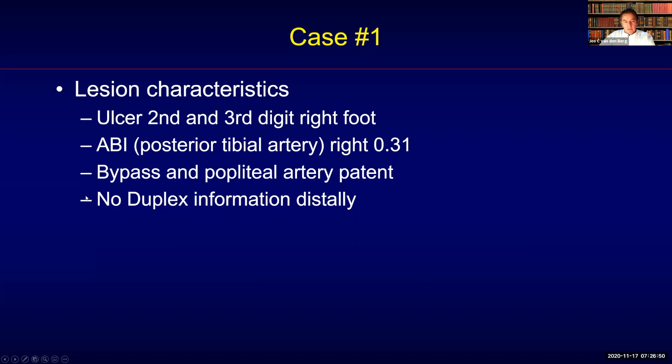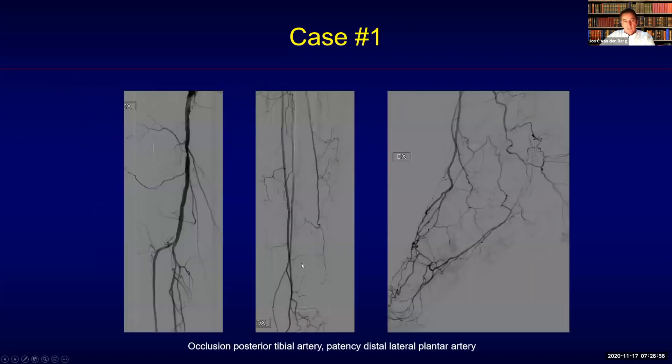The bypass and the popliteal artery were patent. We didn't have any duplex information distally. On the angiographic image, you can see an occlusion of the posterior tibial artery and patency of the distal lateral plantar artery.